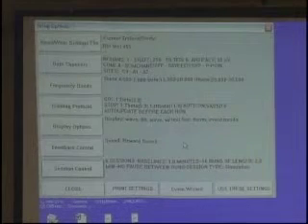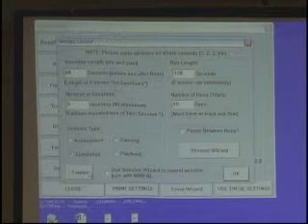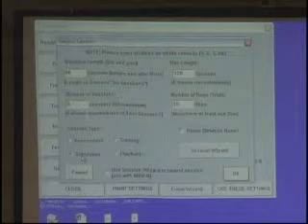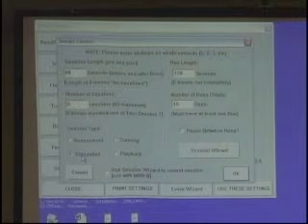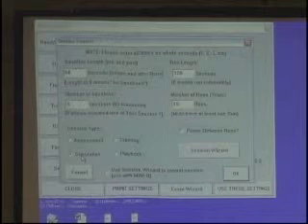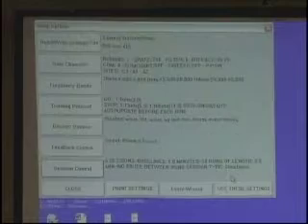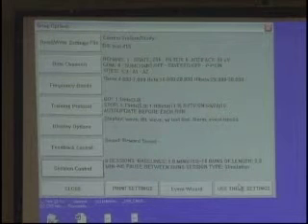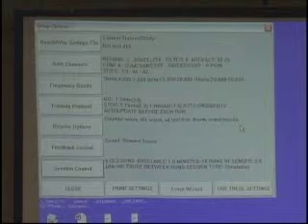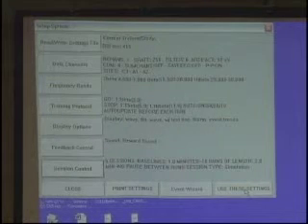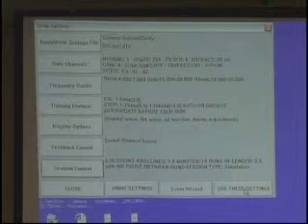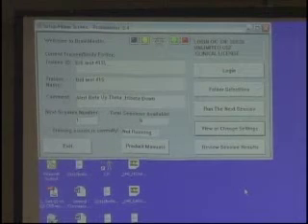Now that we've looked at all the different options in setting up our protocol, let's take a look at what it would look like from the training screen. For this particular exercise, under session control I turned on simulation, because we don't have electrodes on anybody's head. I'll hit OK, and at the end of making all these changes we always want to use the 'Use These Settings' button — this basically saves the settings we made.